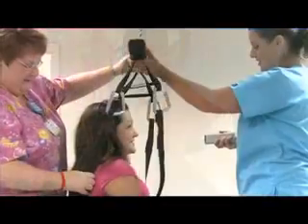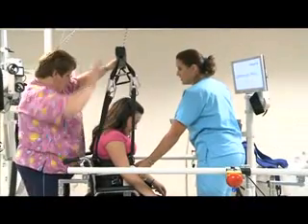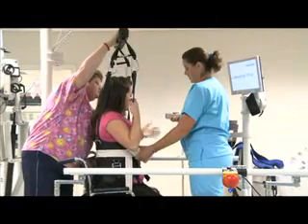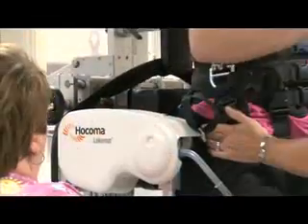Once you're strapped into the Lokomat system and you're raised up in the air is when you'll feel the most pressure around your abdomen, your stomach, and your groin a little bit. That's where the harness is actually taking the weight off of your legs and lifting it up onto the Lokomat system.